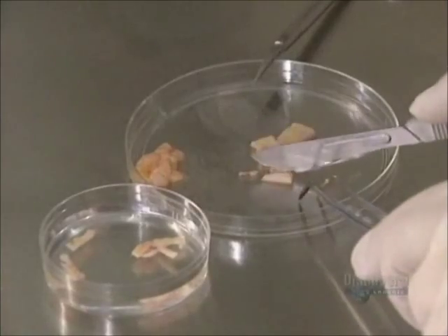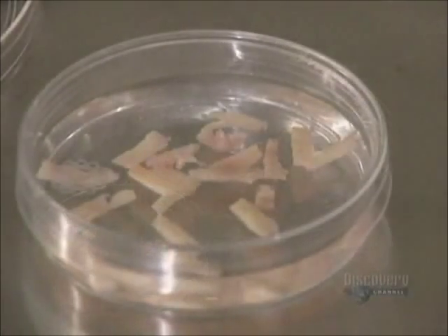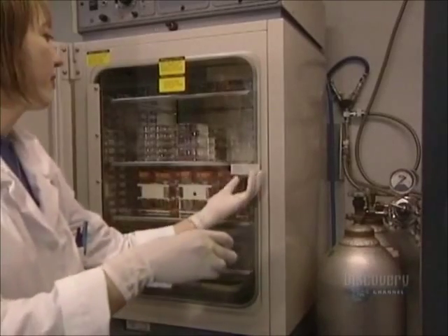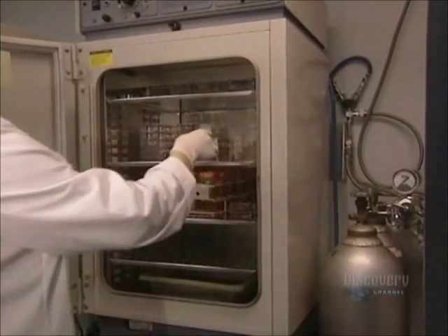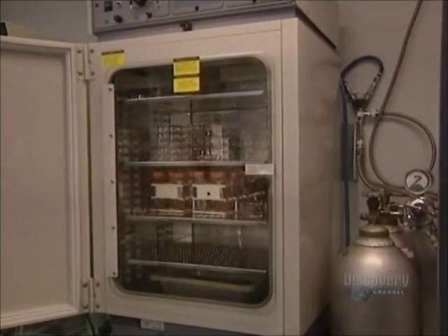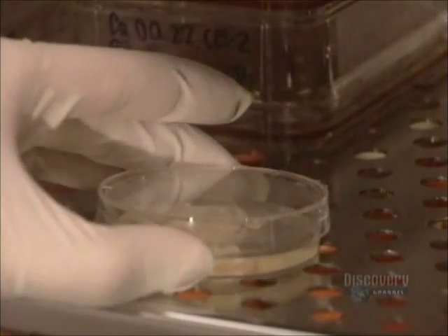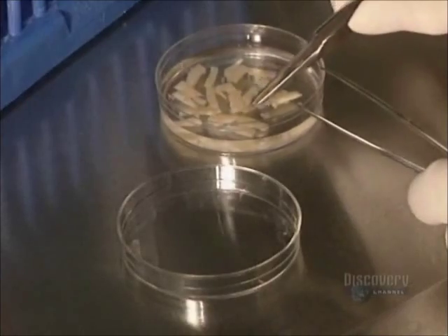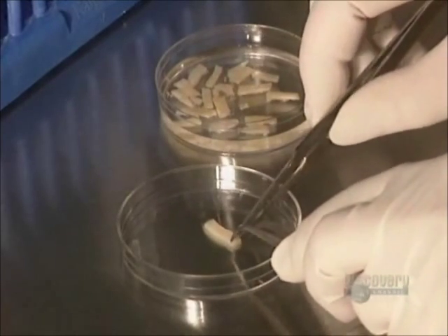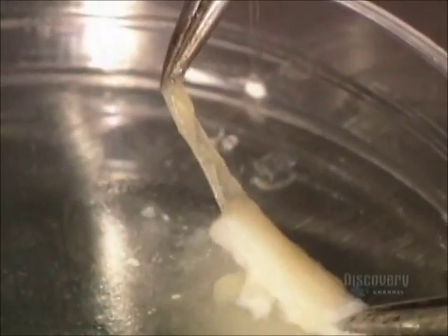The skin is cut into thin strips because thermolysin, the enzyme which separates the dermis from the epidermis, acts more efficiently on small surfaces. The enzyme destroys the links uniting the dermis and epidermis cells. This procedure is carried out in an incubator over three hours at a temperature of 37 degrees centigrade. Once incubation is over, the petri dish is removed and only the epidermis cells, also called keratinocytes, are retained. The epidermis is detached from the dermis with great precision.